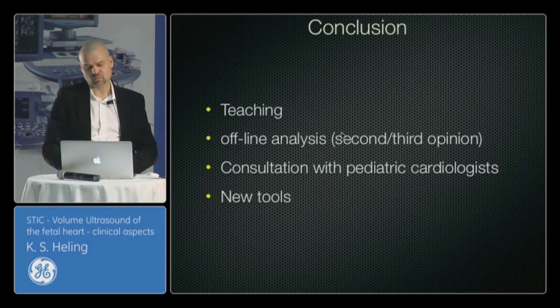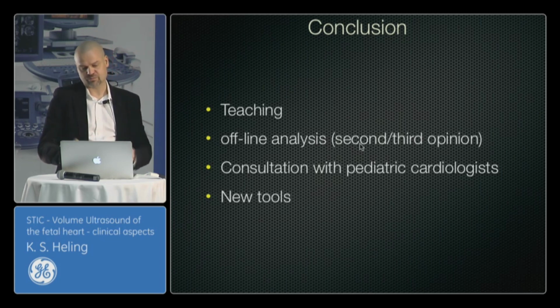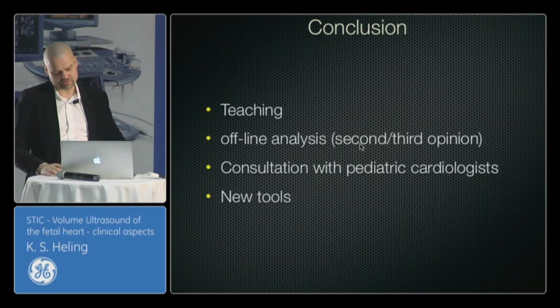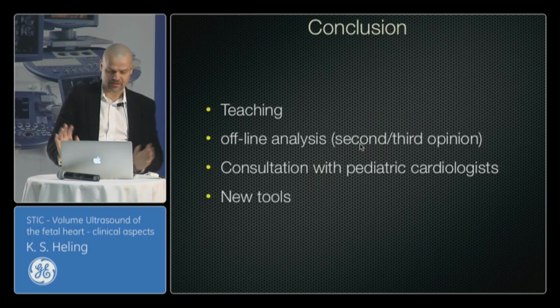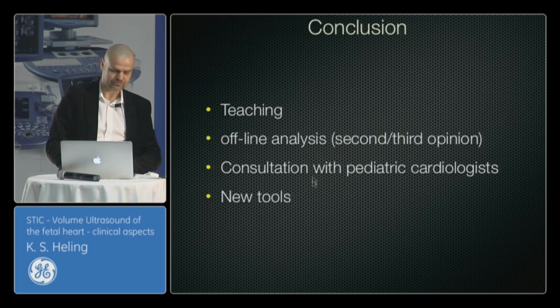at the volume without the patient for a second or third opinion, because if you are not sure in the diagnosis, sometimes it's very difficult for the patient. You do the scan and you discuss what kind of heart defect it is. And we have new tools, and they allow us new advantages in the future. So I think for the fetal echo, STIC is always the future. Thank you.